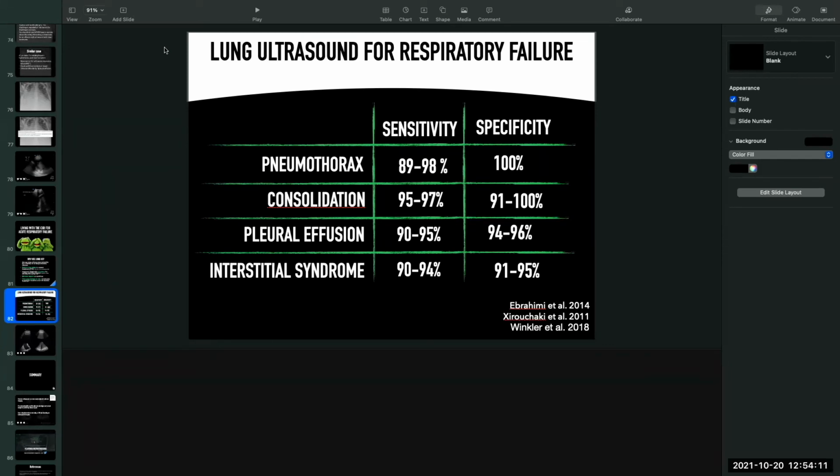You see these sensitivities and specificities. You will figure that out, and you won't waste time, and you also won't waste equipment, and you'll be 100% correct. I know there's lots of times when I was in training where we'd reach for the bronch and we were wrong, and we'd reach for a chest tube and we were wrong. Now with lung ultrasound, you're almost never wrong. So that's the only thing I'll say. And honestly, once you've done an ultrasound, if there's uncertainty after that, that makes for a very complex case, and that argues especially for CT, quite urgently, frankly.